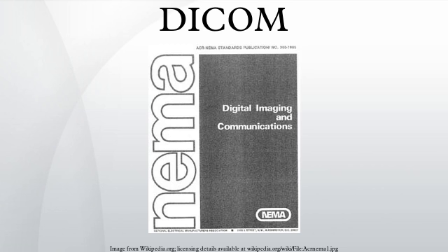IHE, Integrating the Healthcare Enterprise, was founded in 1997 by members of the Radiological Society of North America and the Healthcare Information and Management Systems Society for the purpose of improving interoperability between information systems. The IHE initiative was charged with the task of using existing standards of healthcare data communication such as DICOM and HL7 to improve exchange of medical information beyond the radiology department at the hospital level or health systems level.